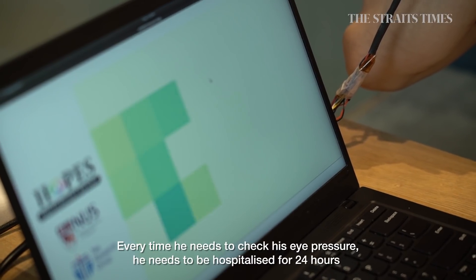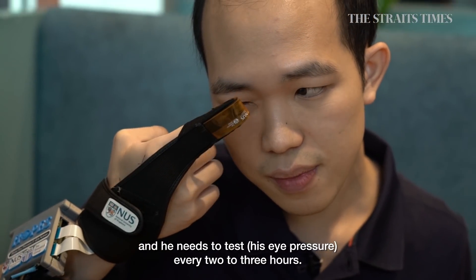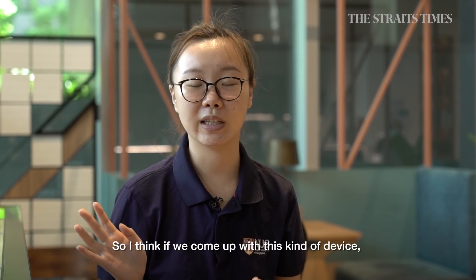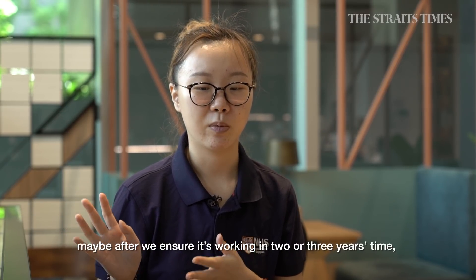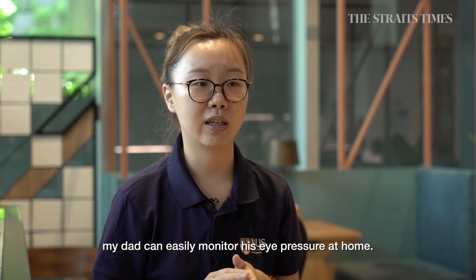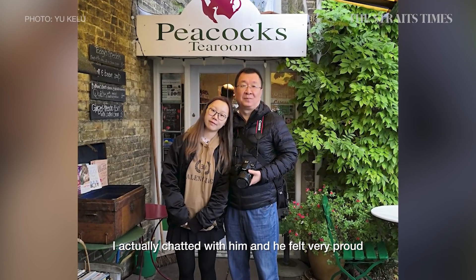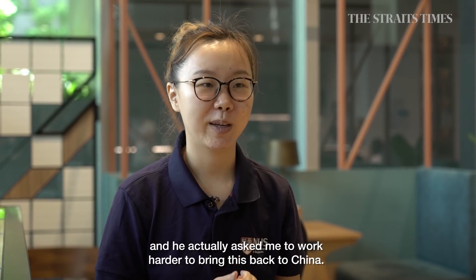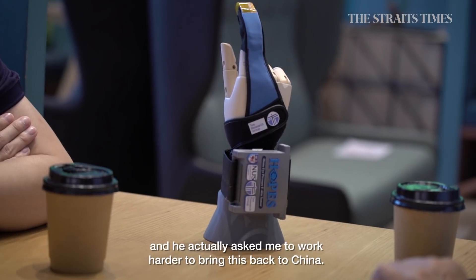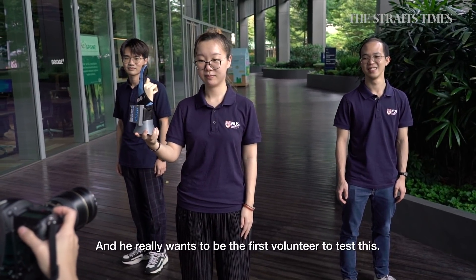Every time you need to check your eye pressure, you need to be hospitalized for 24 hours and test every two to three hours. So if we come up with this device and ensure it's working in two or three years' time, my dad can easily monitor his eye pressure at home. I chatted with him and he felt very proud — he asked me to work harder to bring this back to China.